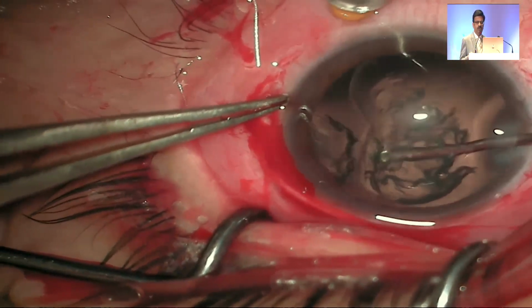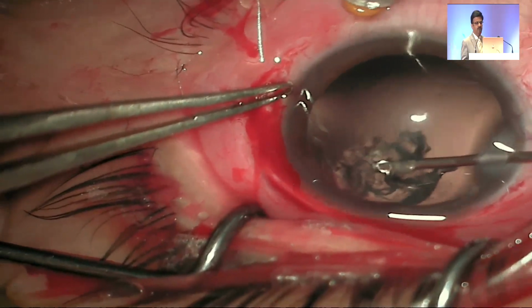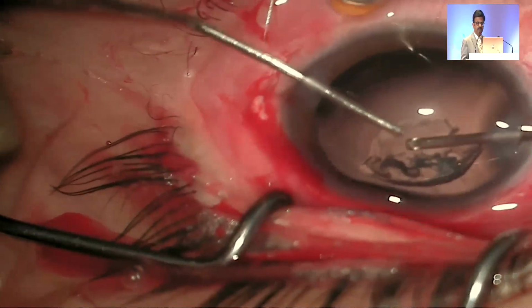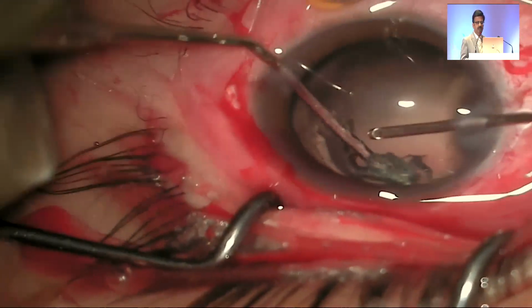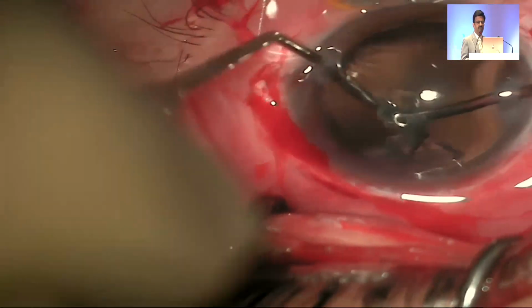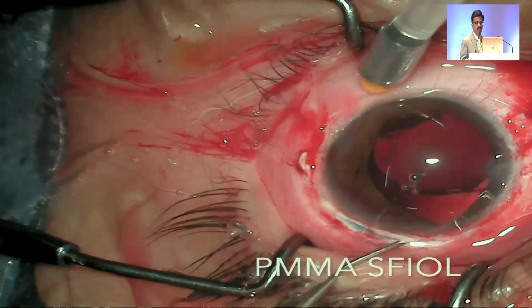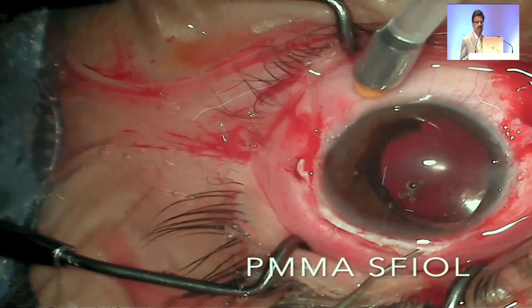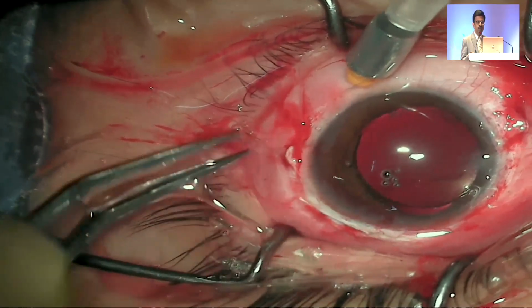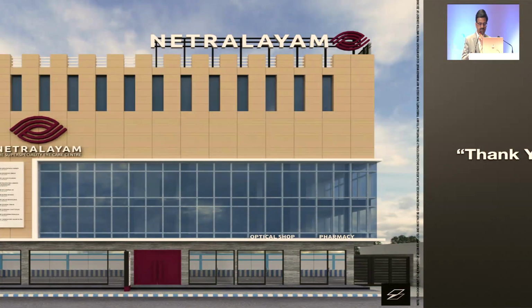After that you can just indent the sclera a little bit to see that the attached portion, the whole of the bag, is removed. Then, using a 9-0 Prolene, a scleral fixated lens can be implanted. And these children also, if you do a neatly done surgery, do quite well. And that's all from my side. Thank you so much.